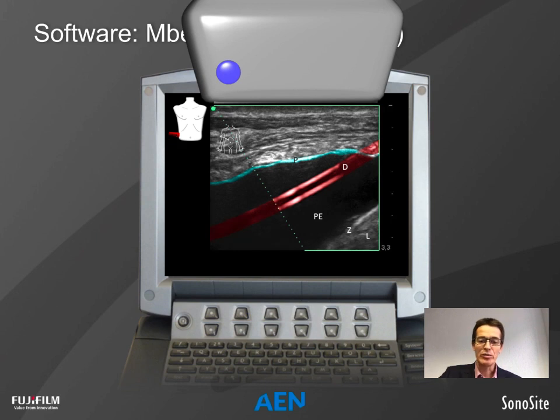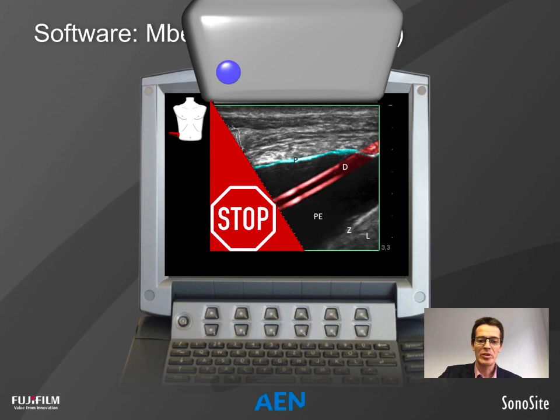The reason is that not many piezos create the B-mode image in this area. So whenever you use this software solution, keep in mind not to have your target structure outside of this field. Visibility of your needle tip will be worse than not having this mode on.